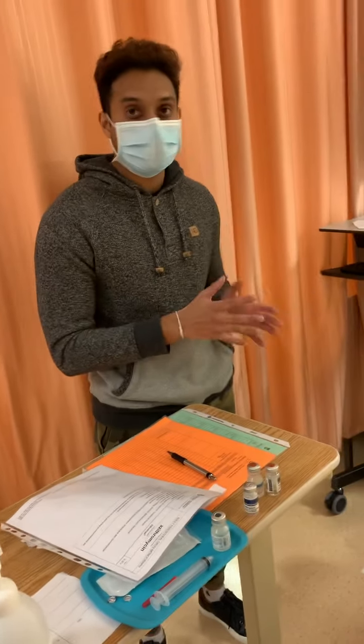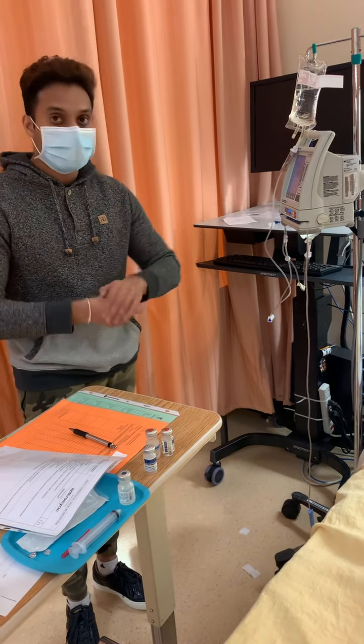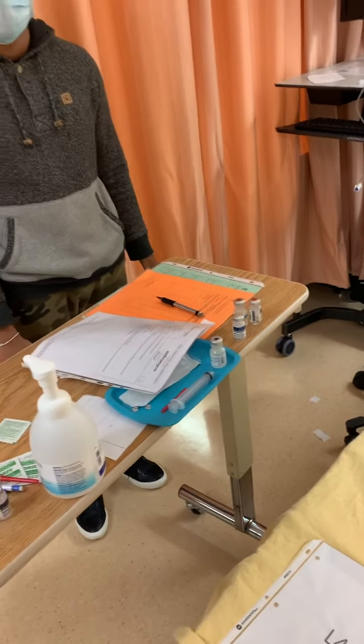And we're just going to now write an IPN if necessary. And we're just gonna make sure to stay with the patient for a minute just to ensure that their IV site's all good. So everything's all fine. IV's running good. We're gonna wash our hands and we're just gonna exit the room. Okay, done.